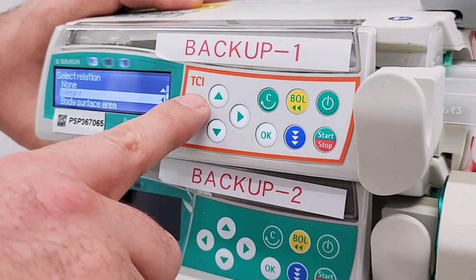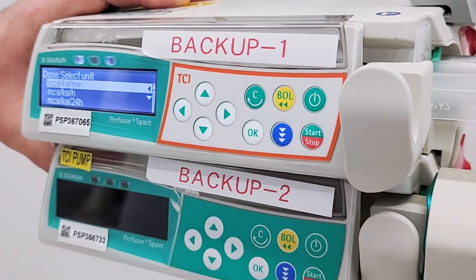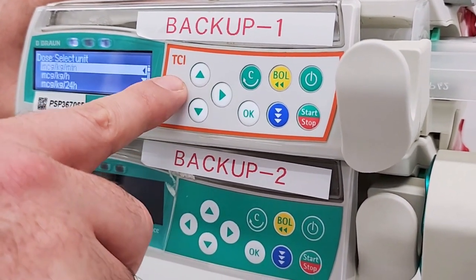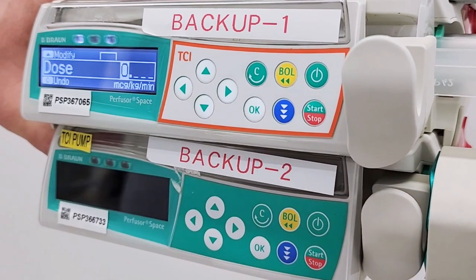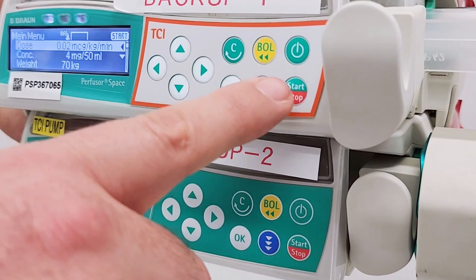Set the patient weight and press OK. Select the unit and confirm. Enter the dose prescribed and confirm it. Then start the infusion. The rate will be automatically calculated and displayed at the bottom of the screen.